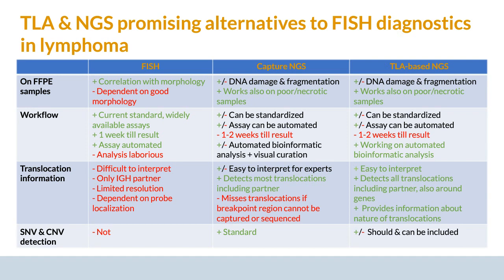FISH, of course, is the current standard. And the nice thing with FISH, which is not on this slide, is you don't need a whole complicated computer infrastructure. It's really just doing the analysis on a microscope, and there's a whole lot of places where this can be done in small labs. You need highly skilled people, but you don't need that complicated computer infrastructure.